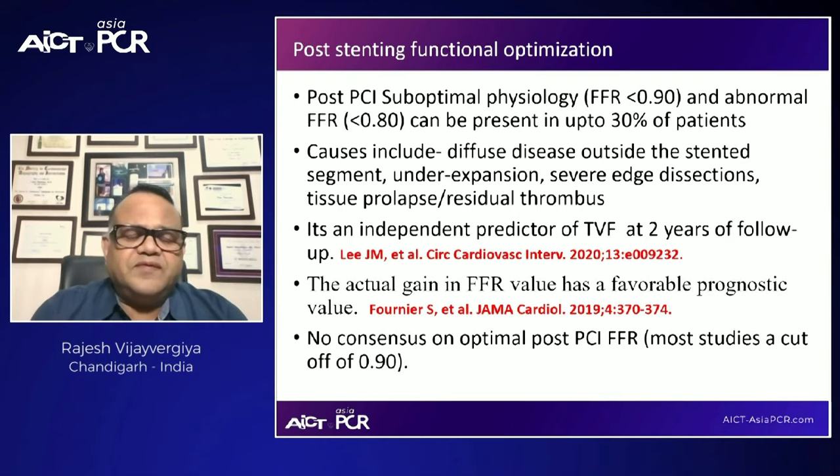Recently, the role of FFR has come up in the post-PCI patient to assess the stented segment, and it has been found that an FFR value of less than 0.9 is suboptimal, and less than 0.8 is not acceptable. It has to be more than 0.8 following the PCI.